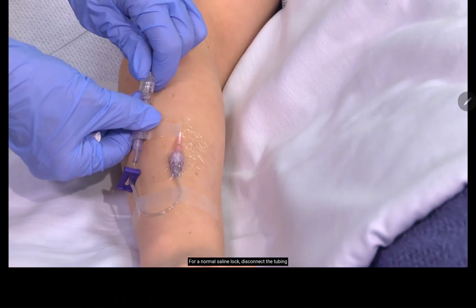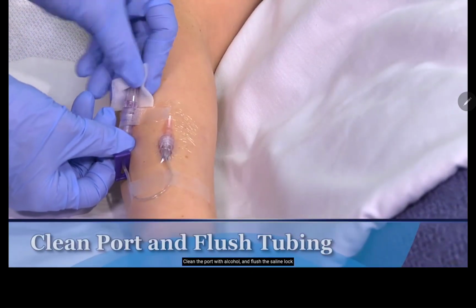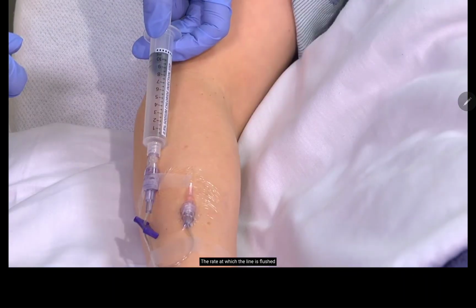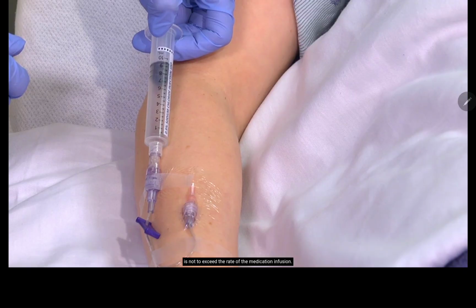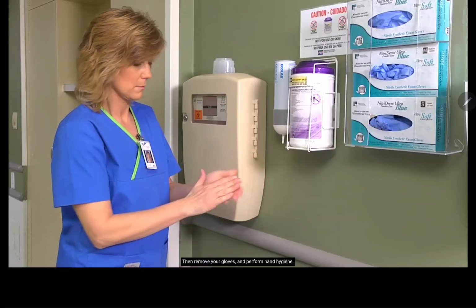For a normal saline lock, disconnect the tubing and cover it with a sterile cap. Clean the port with alcohol and flush the saline lock with 2 to 3 milliliters of normal saline. The rate at which the line is flushed is not to exceed the rate of the medication infusion. Then remove your gloves and perform hand hygiene.